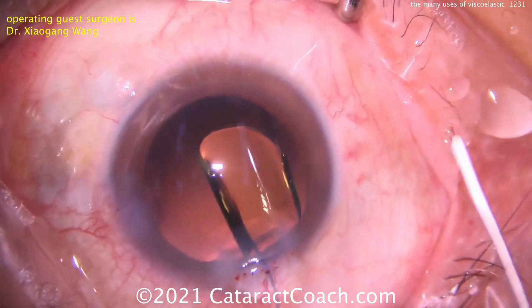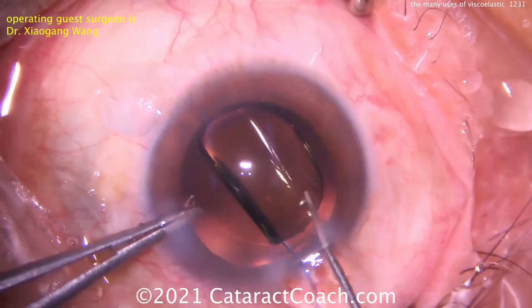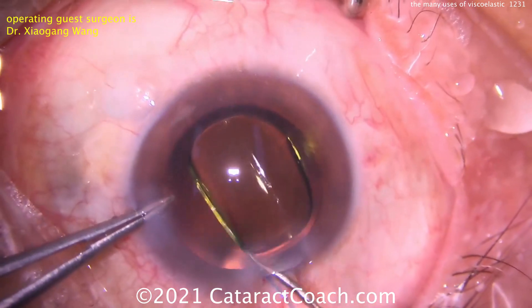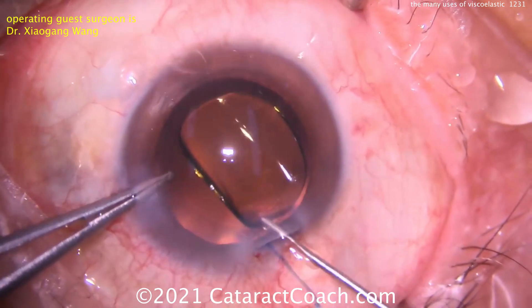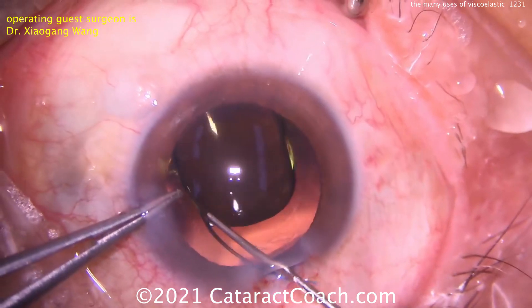So at the end of the case here, we're using a cohesive viscoelastic. Now attempting to get this lens dialed in, using a little hook to dial it around. But look at the incision — losing viscoelastic, AC shallowing. We've got to get this trailing haptic dialed in. Trying again, it just doesn't want to rotate as well as you want.